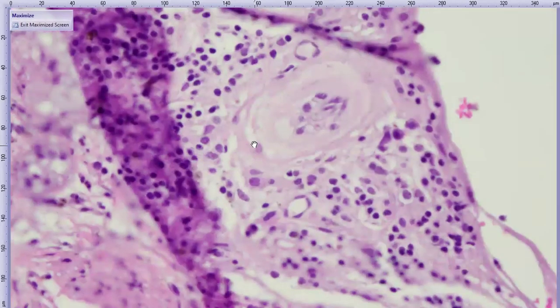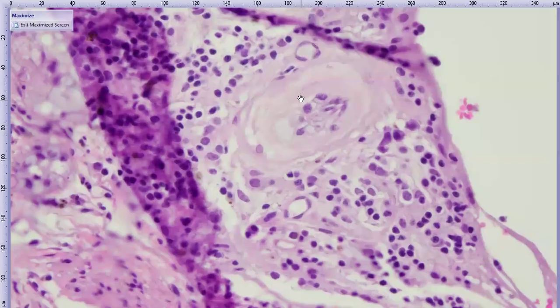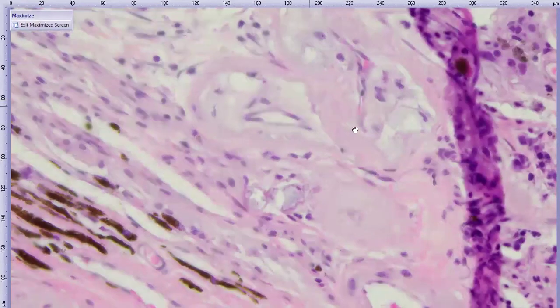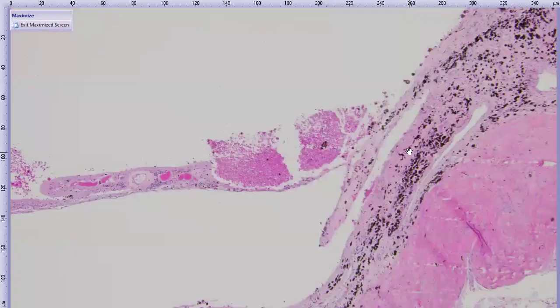And in our central retina, we have severely thickened vessels. So this is formerly a retinal vessel, a little hard to make out the lumen at this point. And the vascular wall is thickened by more of these lipid-laden macrophages. There's kind of this eosinophilic, sometimes hyalinized material here, and sometimes mineral within the vascular walls. So these changes are consistent with atherosclerosis. And those are the major findings.